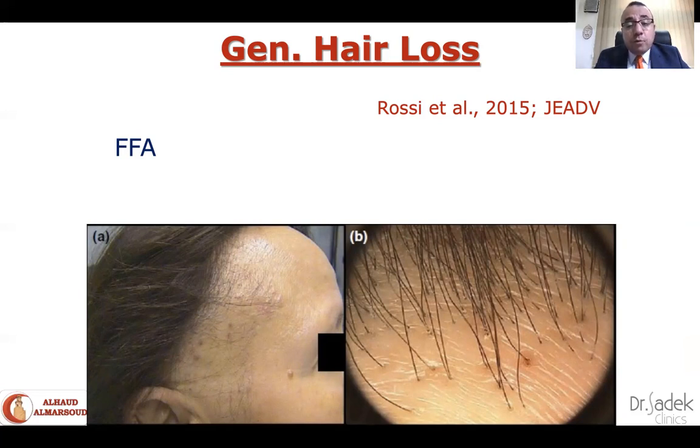For frontal fibrosing alopecia, we all know that clinically there is a recession of the anterior and the temporoparietal hairlines, and dermoscopically we never see vellus hair at the original site of the hairline, but we only see terminal hairs that are regressing, that are usually single hairs. Sometimes we see a deserted single hair in an island.